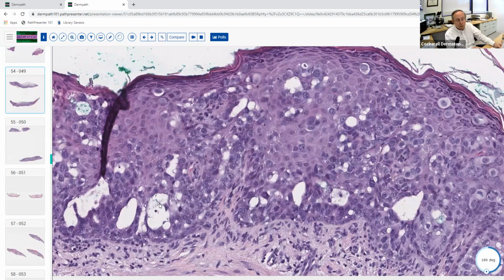So other choices here. Squamous cell carcinoma in situ, well, no, you wouldn't get glandular epithelium in that, so you can rule that out here, although there is a form of Pagetoid Bowen's disease that I think we saw earlier. Melanoma in situ can also give you Pagetoid morphology, but it wouldn't look good here. So we're not even giving you any stains here, by the way. We're just giving you the morphology. Advanced AK, well, no, would never be that.